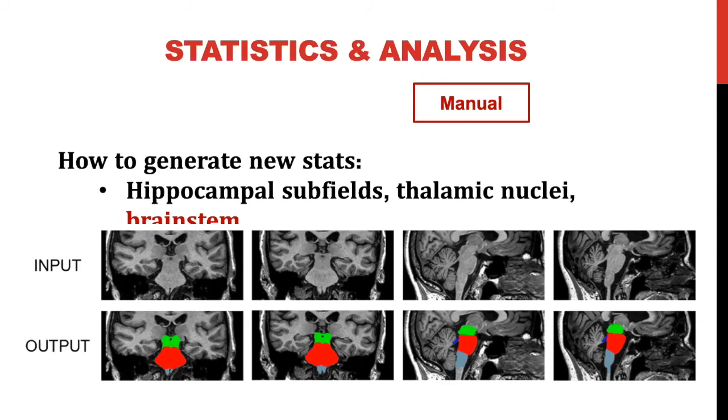And now I'm going to pass it off to Ren, who's going to chat about, it's kind of a doom and gloom thing going on, but what happens when FreeSurfer messes up and how to fix it.